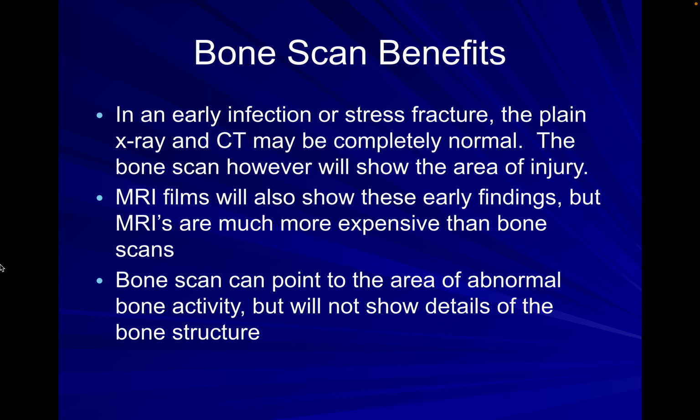It is particularly sensitive in early processes of, for example, infection or stress fracture, that oftentimes the x-ray will miss, and maybe less often the CT will miss, but the bone scan will pick up.